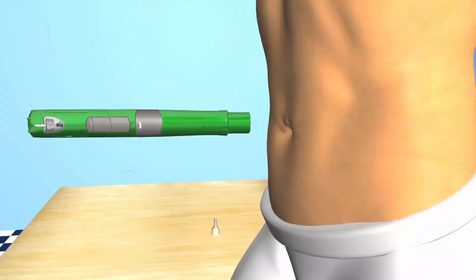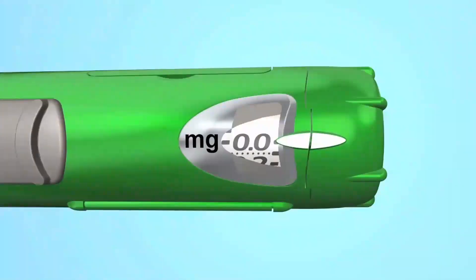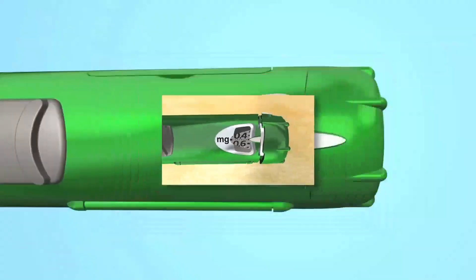Now check your dose window. If the dose window shows 0.0 and the triangles in the end of the SurePal line up, your dose is complete. If the dose window does not show 0.0, this means the cartridge is empty but your dose is not finished. Your SurePal knows how much you still have to inject and you can finish the injection with a new preassembled cartridge.